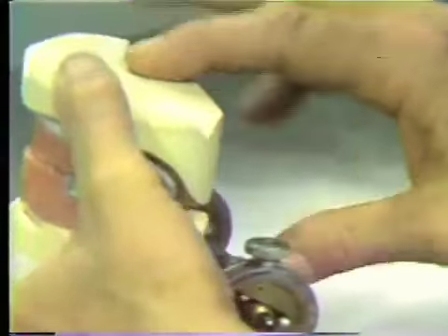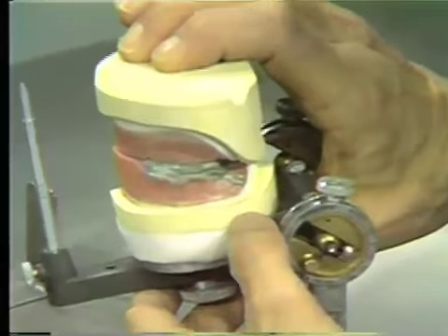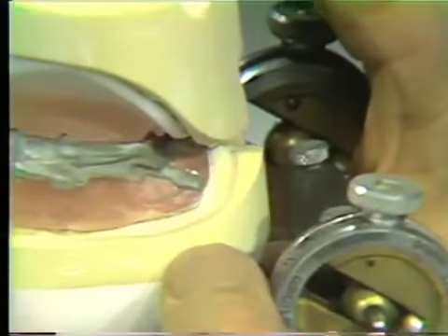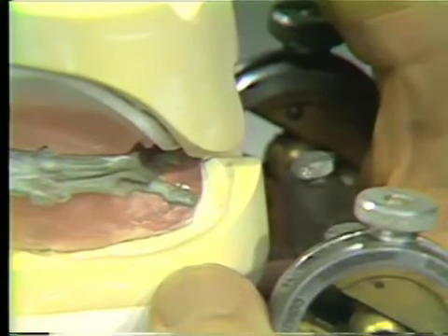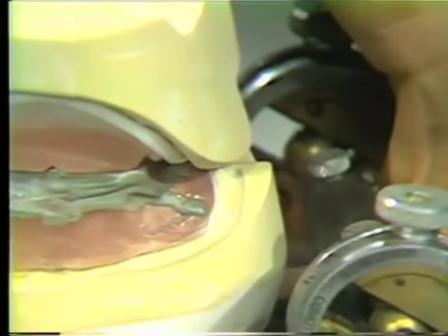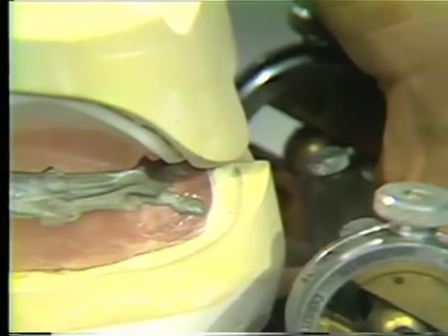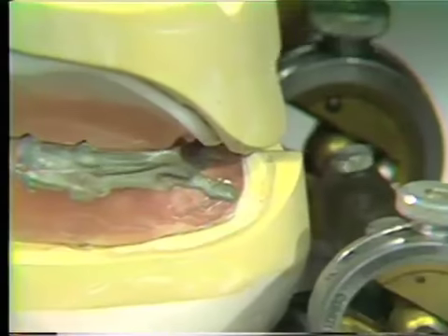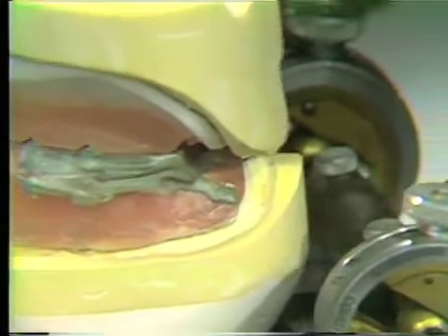and check carefully this relationship of the heels. Both the heels of the base plates and the heels of the cast must have space between them so that wax and wax alone is recording our relationship. If the heels of the cast are touching, now is the time to reduce those until we do have an adequate space between them. As we can see here, the casts are not touching and the base plates are not touching. So in this position, we will mount the lower cast to the upper.